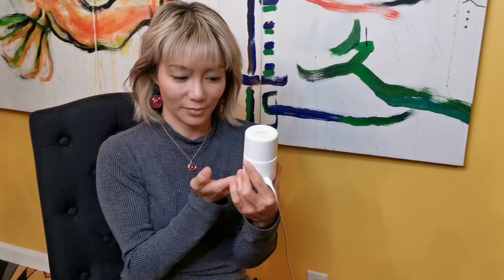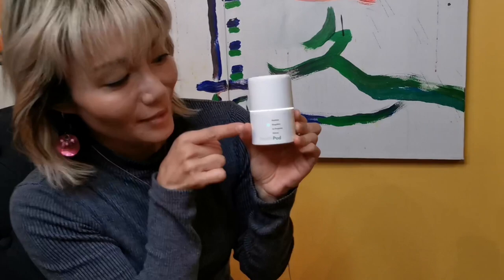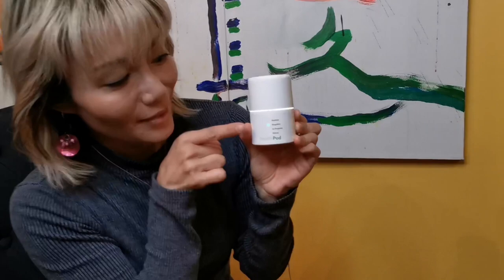My test result is ready. I am negative. Yay! I am negative.